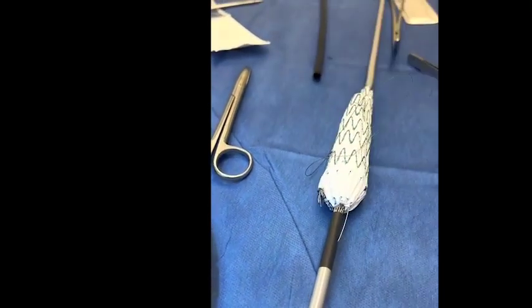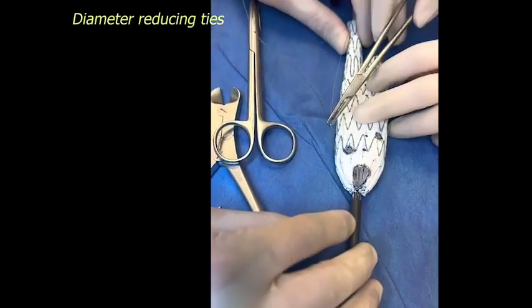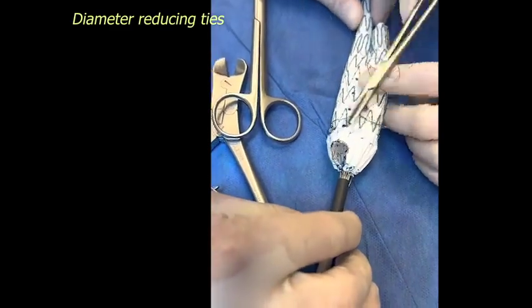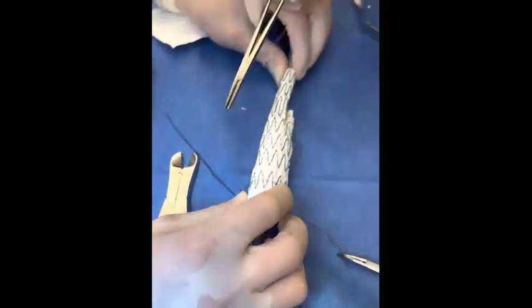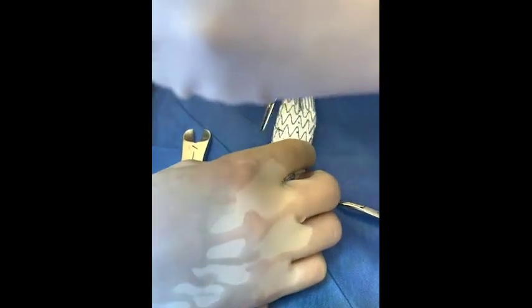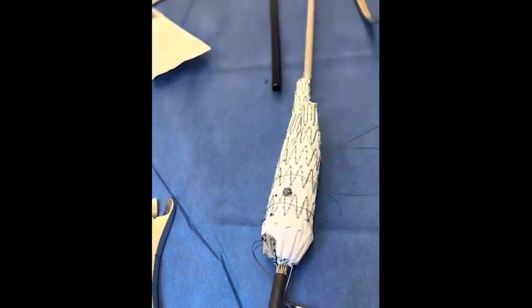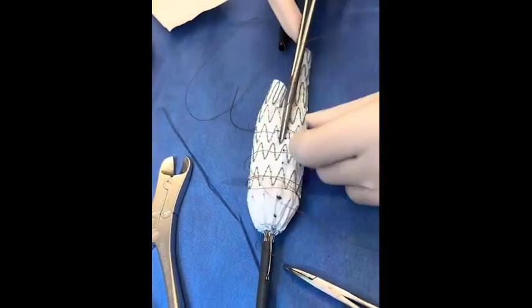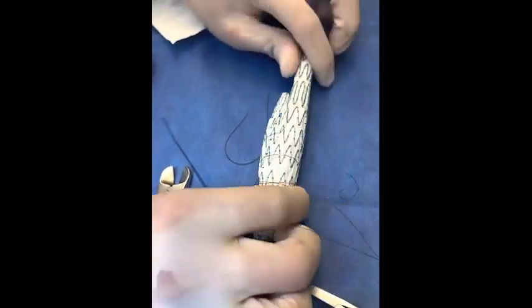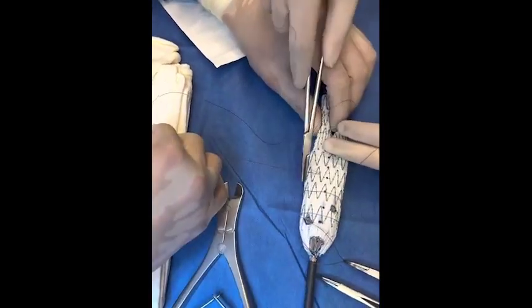Next, the graft is constrained circumferentially using 3-0 chromic sutures. This will be broken in the OR with a balloon after the cannulations have been completed. We often use aortic sizers to size our constraint to a desired diameter to make the cannulations easier. When we perform this part of the step, we use the back end of the needle to run it between the stent and the fabric to make sure we don't create any additional holes in the endograft.